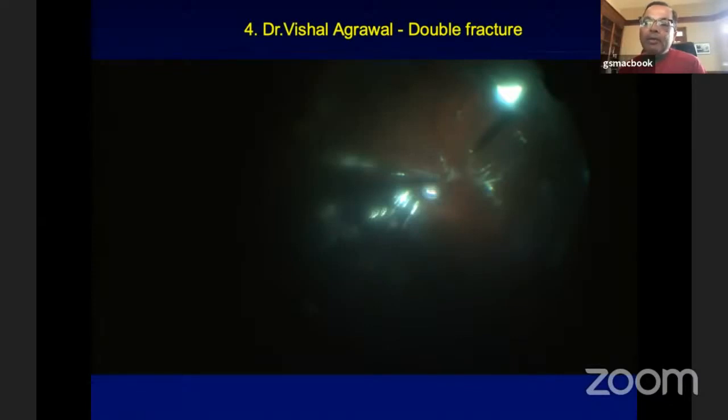Absolutely. And I don't know why people worry about 2 millimeters and 3 millimeters and 4. So I always tell the fellows, put the caliper away. We're not cataract surgeons. Make it as big as you want and 25% bigger, because the last thing you want is to be stuck at the vitreous base in a phakic patient, and it makes it a bigger problem. So one piece of advice to all the younger people, don't do that. Don't think like a cataract surgeon, think like a retina surgeon. Make it bigger and just take it out.